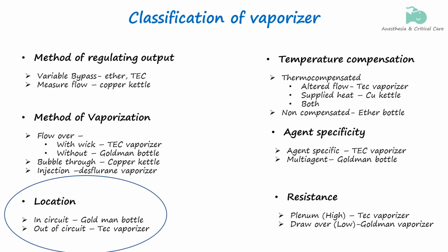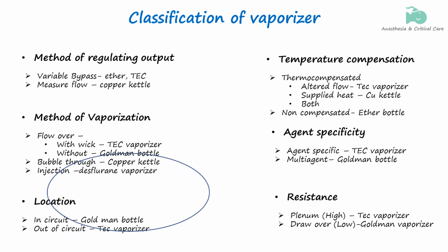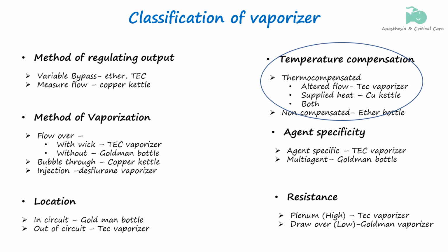In the physical principle video on the anesthesia vaporizer, we have seen that during vaporization, the liquid molecules absorb energy or heat to break free from the liquid phase and enter the vapor phase. As the liquid anesthetic vaporizes, it absorbs heat from its surroundings, which can cool the remaining liquid. This cooling effect can lower the vapor pressure of the anesthetic agent, affecting the amount of vapor produced.